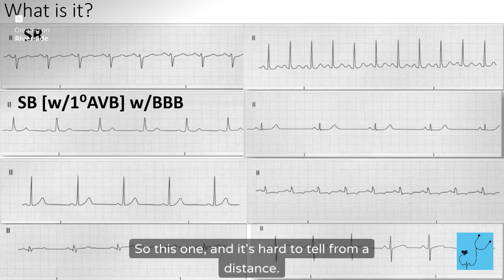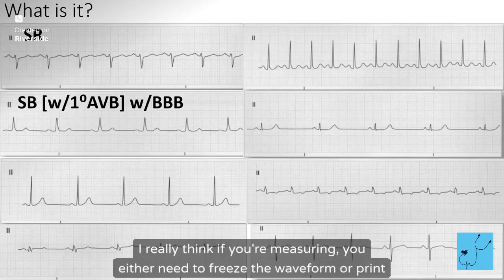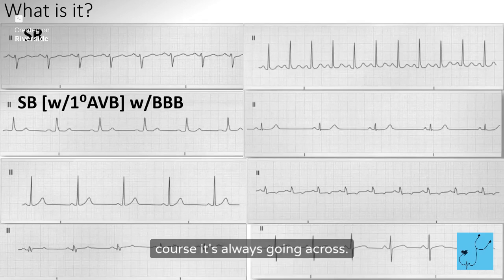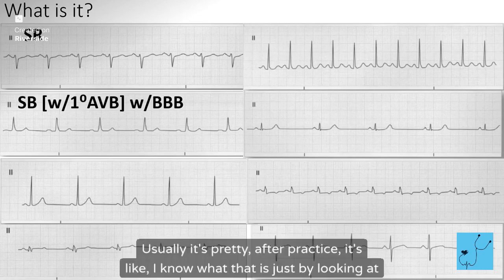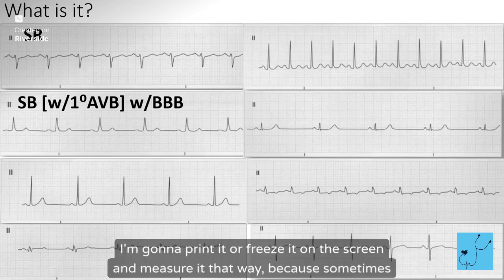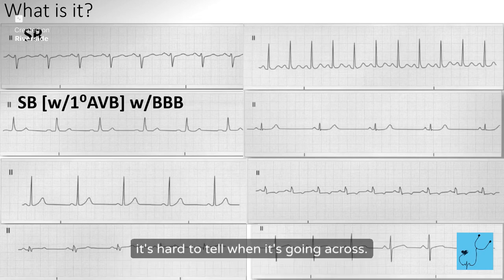So this one, and it's hard to tell from a distance. I really think if you're measuring, you either need to freeze the waveform or print it out. Whenever I'm having a problem looking at my patient on the monitor, and of course it's always going across, usually after practice, it's like, oh, I know what that is just by looking at it. Sometimes it's like, I'm not sure. I'm going to print it or freeze it on the screen and measure it that way, because sometimes it's hard to tell when it's going across.